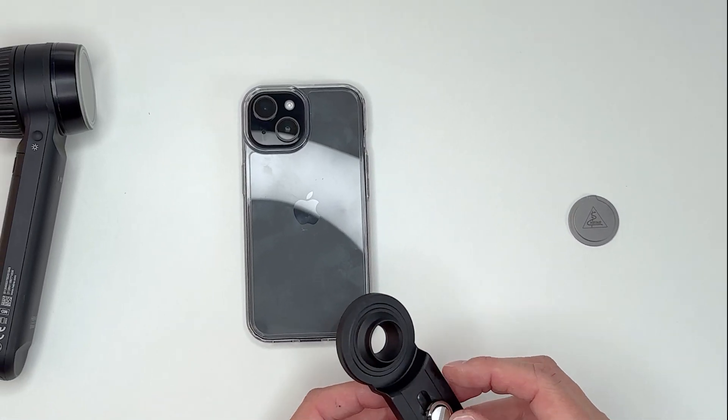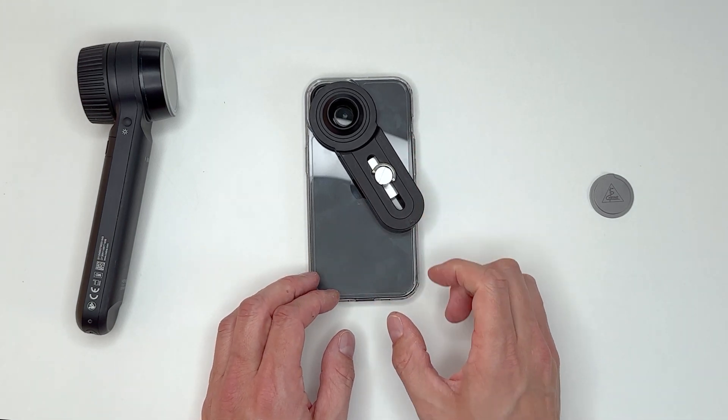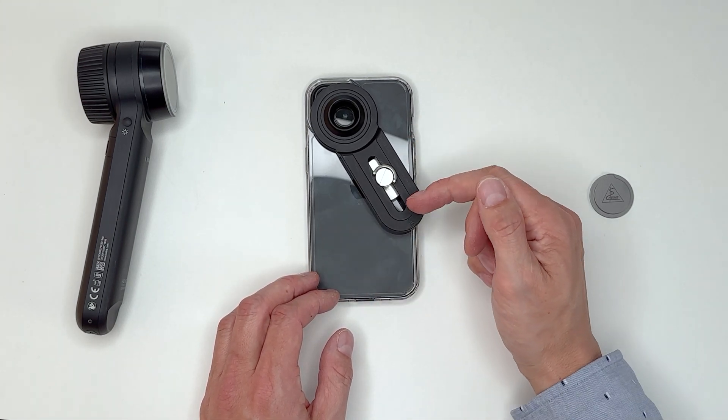First, place the handle on the main smartphone camera to determine the ideal position for the fixing button before attaching it to the smartphone case.